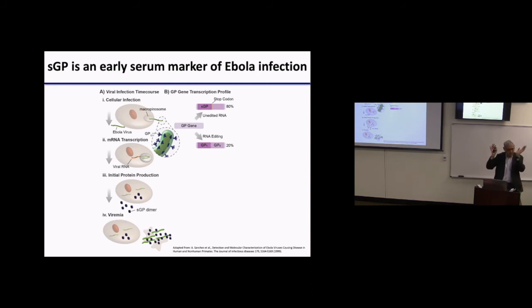It also has ways of getting rid of cellular-mediated immunity or attack. And only 20% is actually the transcript that makes the viral capsid. So this is obviously a great marker to go for, because the virus is amplifying its presence by sending out this message. It's actually broadcasting that it's there, except it's using it to fool the body. It was pointed out many years ago by somebody at CDC, whose name I can't remember, that this would be a great marker to go for.